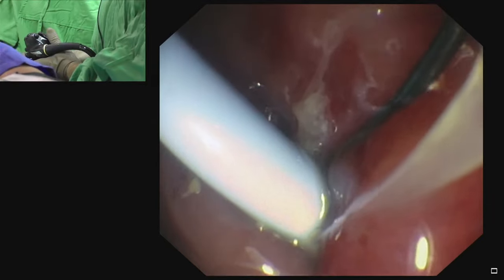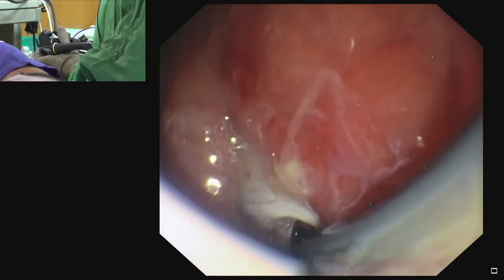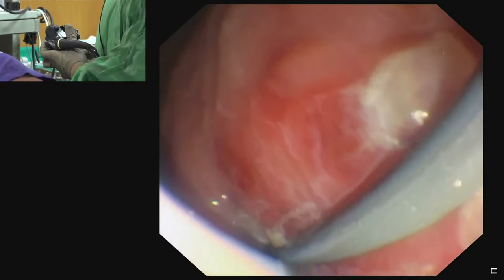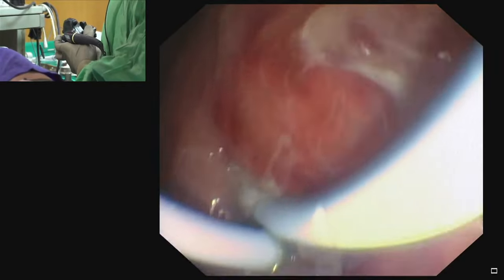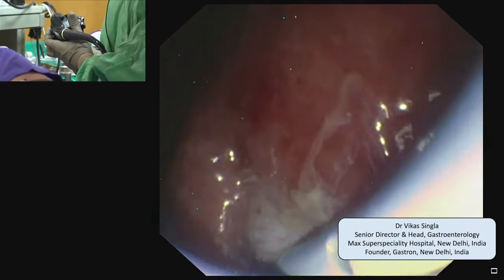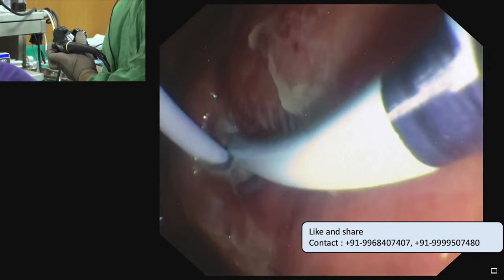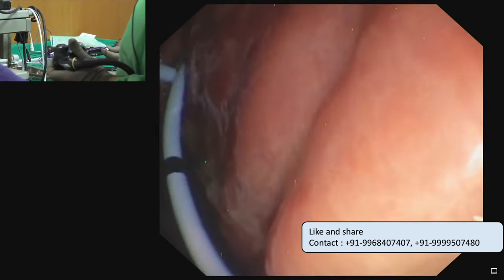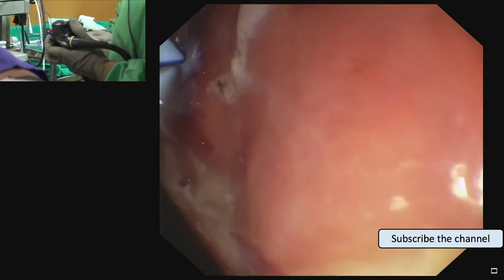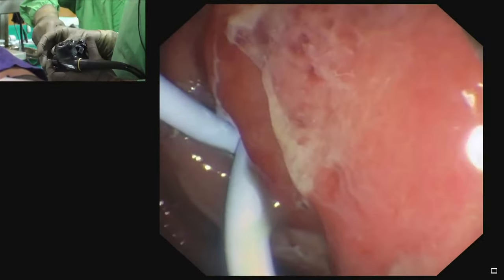Over the wire, we first pass the catheter inside and form a loop inside the walled-off necrosis. The catheter has gone inside. We then pass the plastic stent — we can see the stent with holes on one plane. The first black marker is visible; pushing further inside, we remove the guidewire at the second marker. The inner catheter is removed and the stent is pushed with the sheath. We have now deployed two plastic stents between the gastric lumen and the walled-off necrosis.